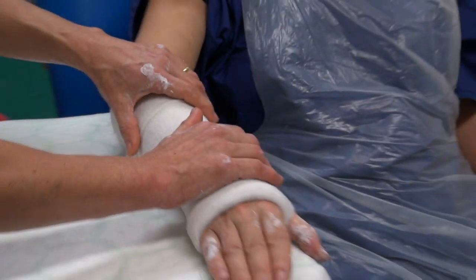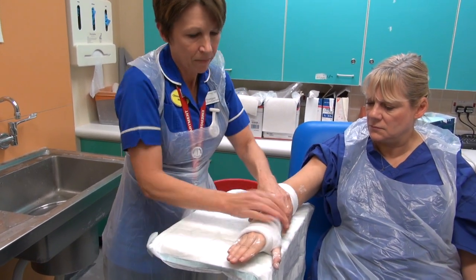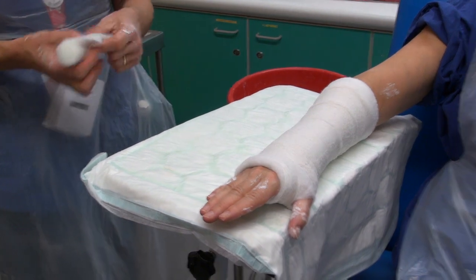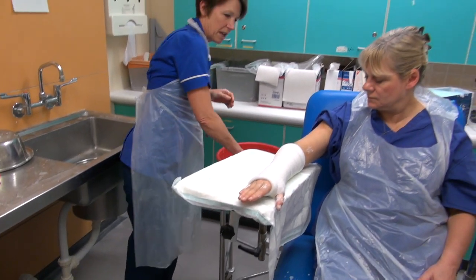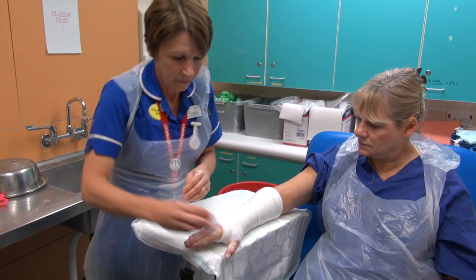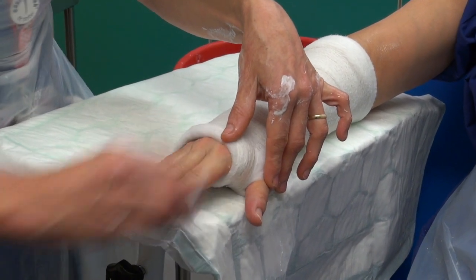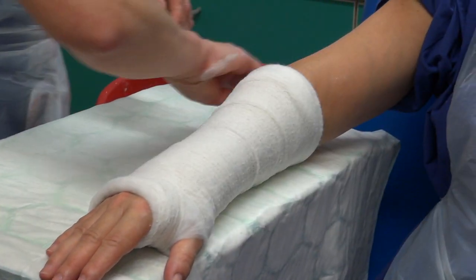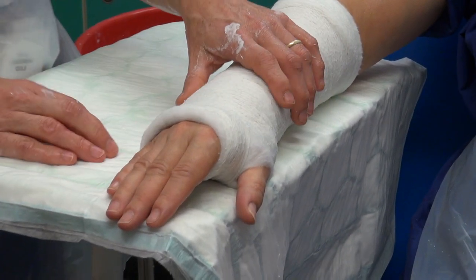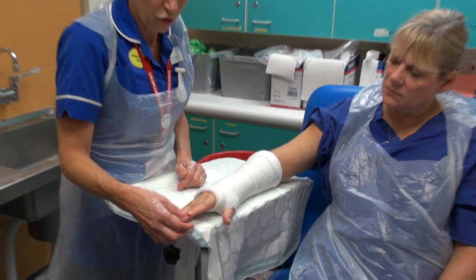I need Mag now to keep her arm nice and still. I'm just going to mould it to make sure it's all snug. She needs to keep still now just to allow the plaster to start to harden. Are you OK there? While that is happening, I'm going to give Mag a little clean just to get rid of any plaster that is against the skin, and then I'll dry that off. So that has had a chance to harden off a little bit — I'm just going to check the circulation again by doing a capillary refill check, and make sure Mag is nice and comfortable.